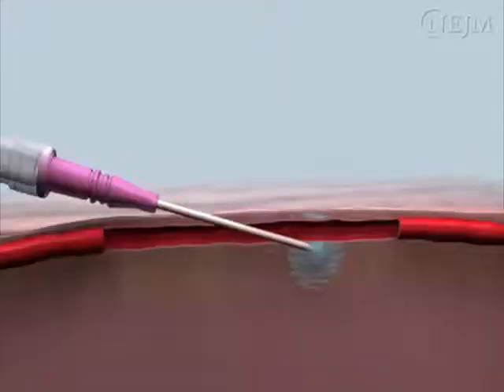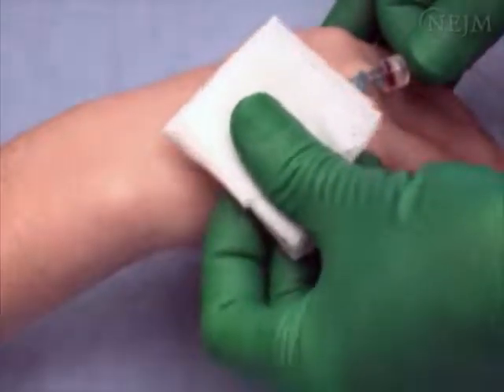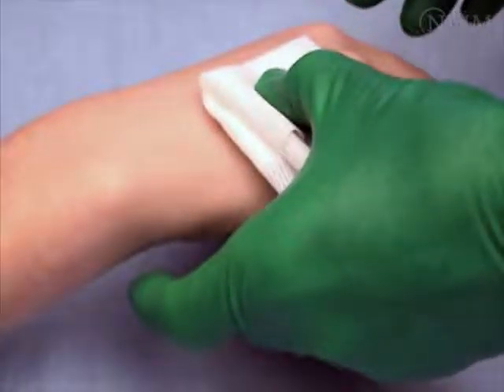Either of these situations can cause pain and swelling at the insertion site because the intravenous fluids are administered into subcutaneous tissue. When this occurs, the cannula should be withdrawn completely and another cannula should be placed at an alternative site. When a cannulation attempt is unsuccessful, the subsequent attempt should be performed in a vein proximal to the initial puncture site.